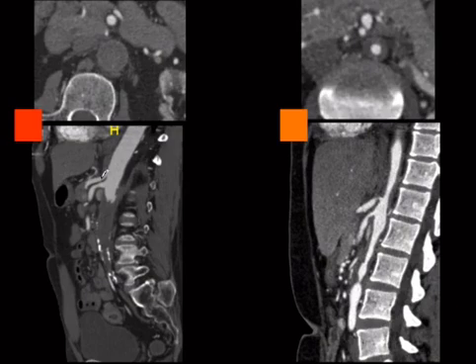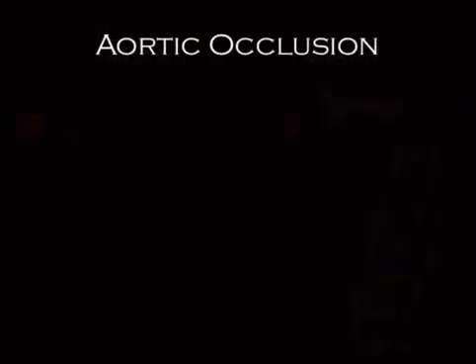I would say, this person's old. How do you know they're old? I can tell they're old because I see a little endplate spurring here, degenerative change in the spine. I can see that there are intimal calcifications there. Young people don't get that. This person looks young to me. Look how clean that spine is. That's a young person's spine. I'm seeing no intimal calcification at all. I'm inferring this person is young, so this person has Takayasu's. This person is old, so this is just atherosclerosis.